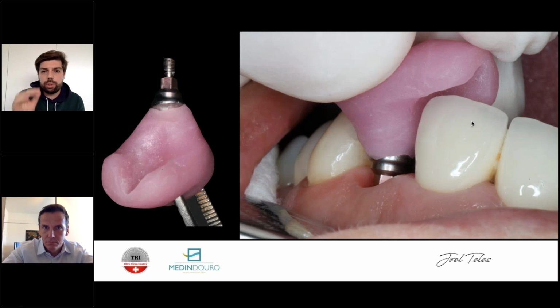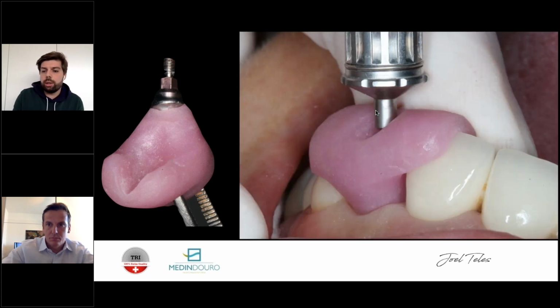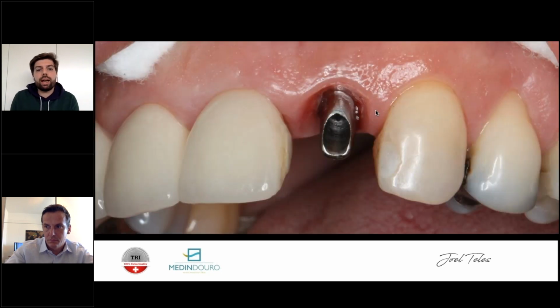And these are the two small tips. I use a jig in order to place the restoration in the perfect spot, and this jig is very easy to make. So you place it in and you can give torque to your abutment. And I use the tri-bases themselves, reshaped to be a cemented post. This is the tri-base. And the cementation line should be just a little bit inside, almost at the same level as the tissue, so you don't damage anything.